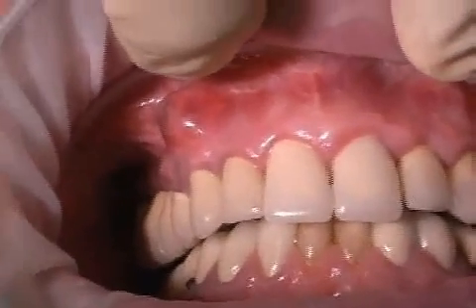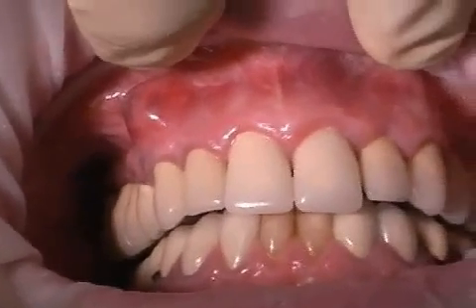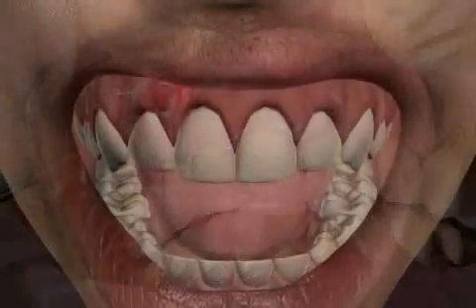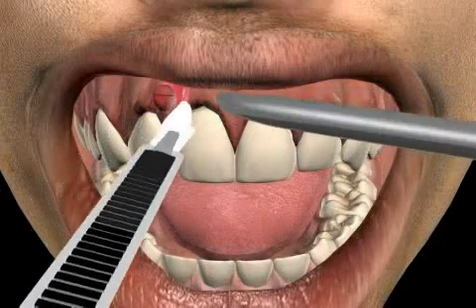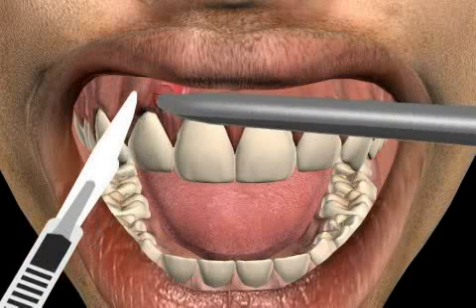You see a patient with an abscess due to a periodontics problem. An anterior incision was made during the acute phase. In order to allow for the drainage of pus, a yodoform strip is put in place. Otherwise, the wound would close up immediately, not allowing pus to be drained and resulting in a return of the acute problems.